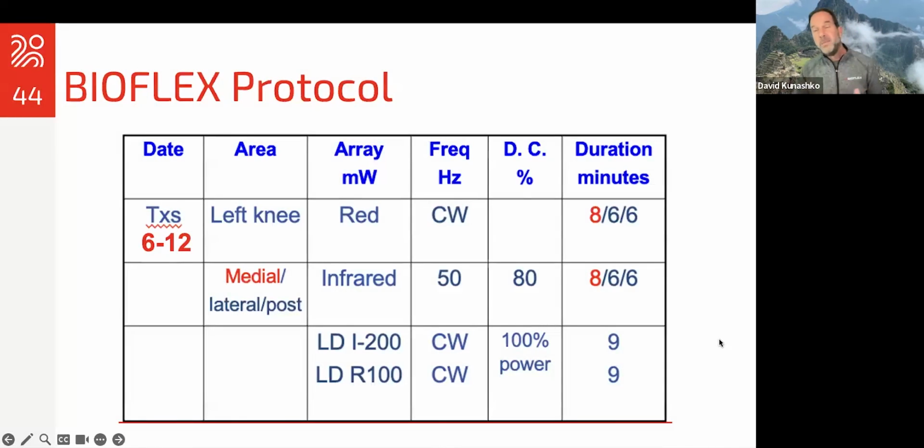Then over time, 3-6 sessions in, if the patient is not responding as well or is slow to respond or plateauing, you can then start to increase the frequency and duty cycle of the infrared and maybe even increase the power of your laser probe. We can do it in smaller increments as well, maybe go from 42% to maybe 60 or 70%, and then 80, 90%, and 100%.